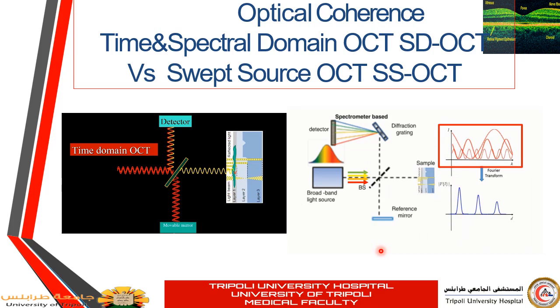The other difference is the light source. It is using a broadband light source instead of monochromatic light.